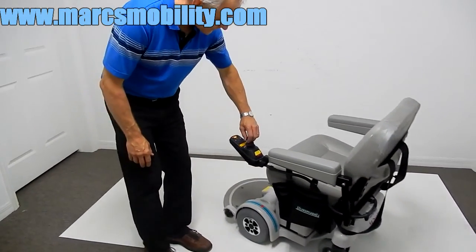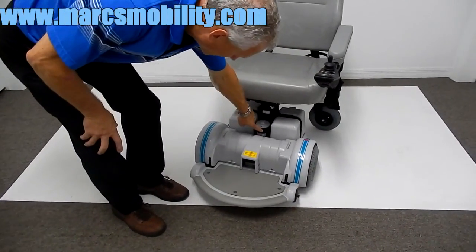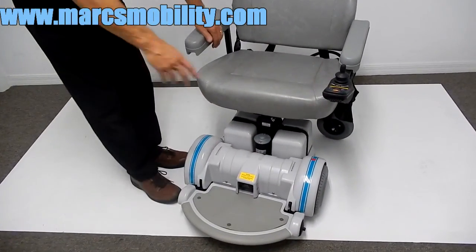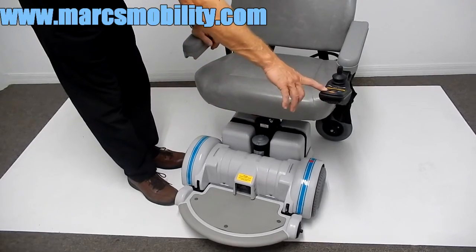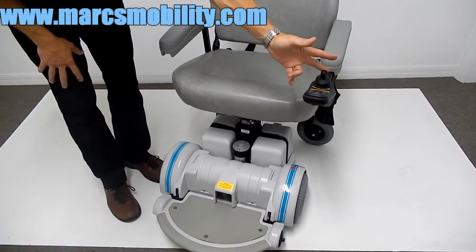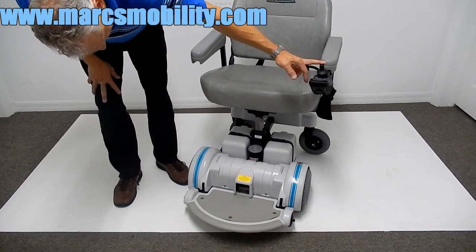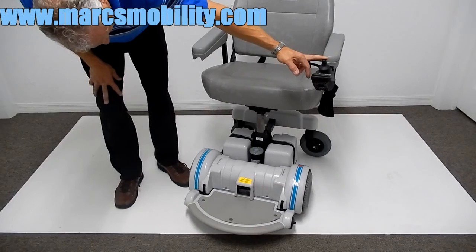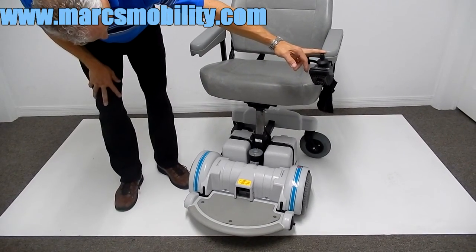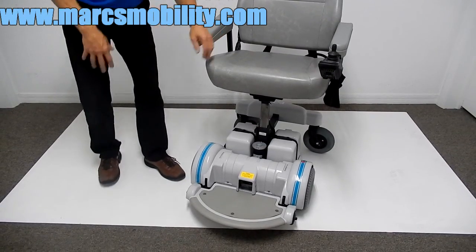You can see the motor for your seat lift in the front. To make the seat go up and down, the only thing you have to do is hit the button here on the joystick, push the joystick forward, and your seat will go up five or six inches. As you can see, this chair will not drive with the seat elevated, so you need to bring the seat back down.